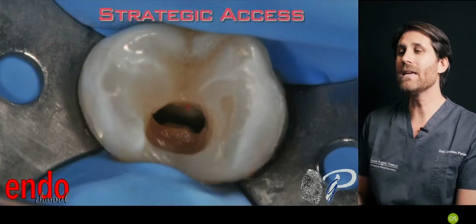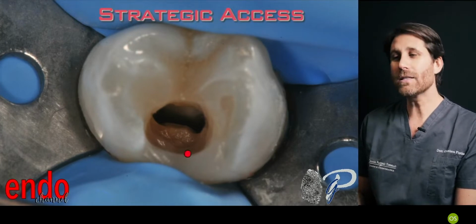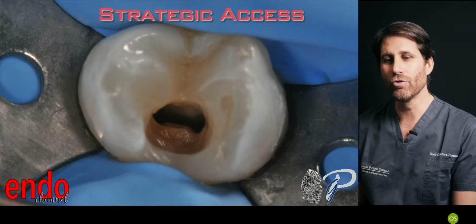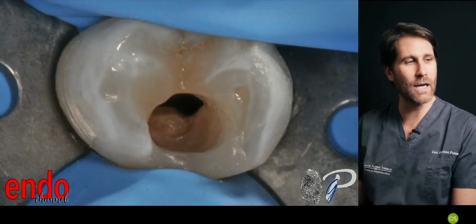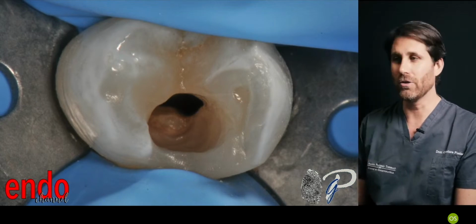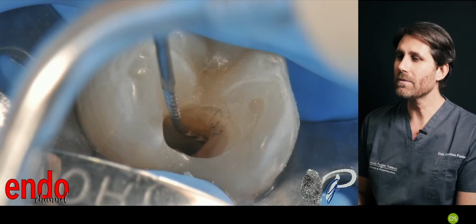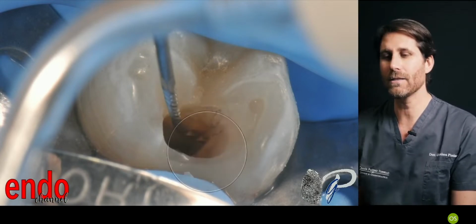If we have a mesial caries or an interproximal caries, just remove the carious tissue and try to access the root canal orifice from this direction. So the caries-driven approach is a strategic approach that helps us to go inside the root canal, trying to maintain as much tooth structure as possible on the sound part of the tooth. Obviously, if we leave some undercuts, then we can clean them with ultrasonic tips. We can go in the undercuts and clean the pulp remnants and the pulp horns.